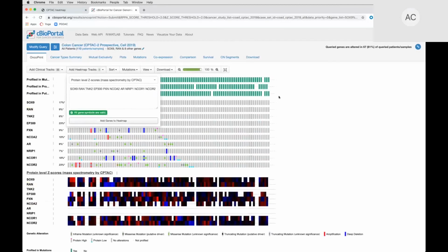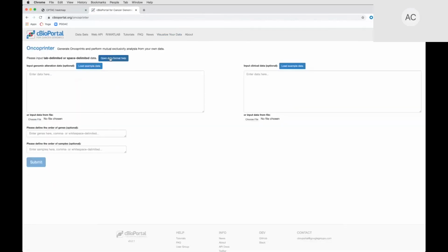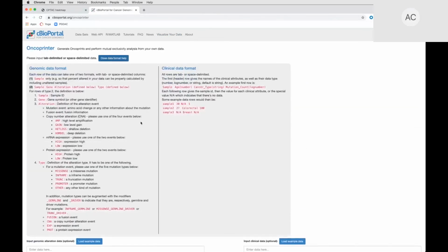But the primary difference is that the data right now here is limited. You can't really see the methylome data, the phosphosite abundance data. The other limitation here is if I just took your data and uploaded it to this particular platform. You could click visualize your data here and then click OncoPrinter. It's actually still very limited what you can actually do.